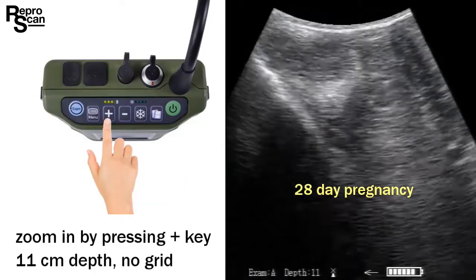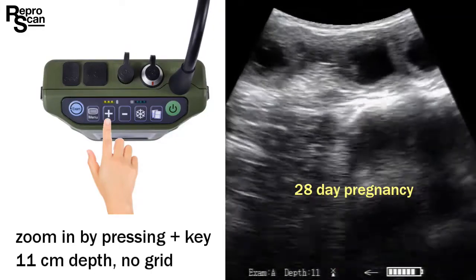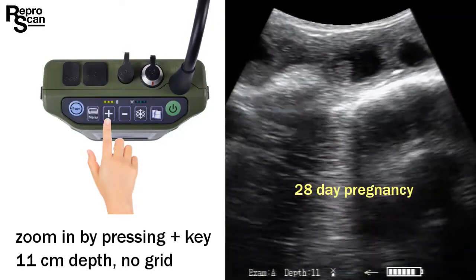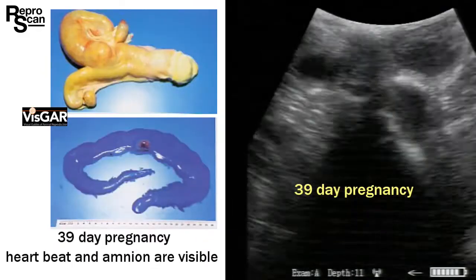Let's zoom in, pressing the plus button on the XTC, and we're going to scroll across that uterus again, and there's a little clearer view of that 28-day pregnancy. On to a 39-day pregnancy.